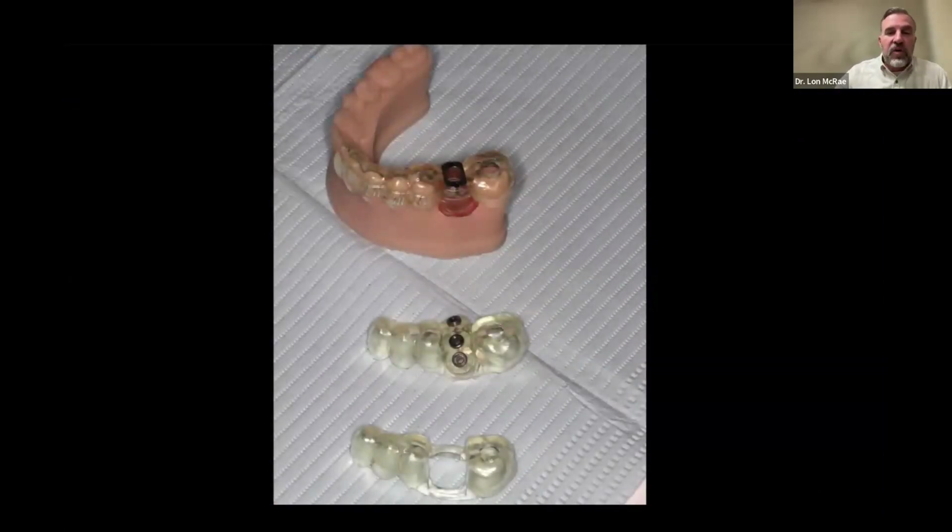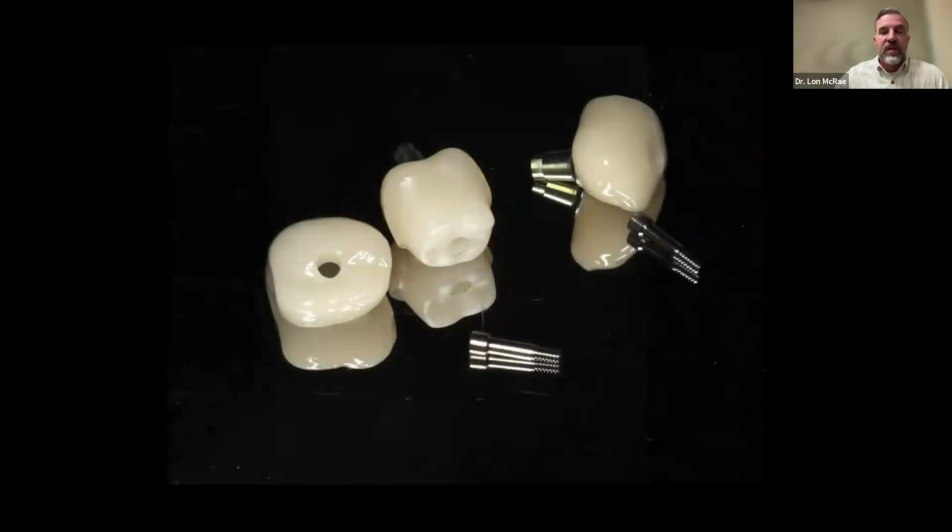So what do I get from the lab? This is what I get, a surgical guide. I then have a guide to be able to go through the furcation. So it's a guide that gives me the ability to split the root in a very precise way. And I have an occlusal guide to use just before that. So I get 3 guides, all from the All-In lab, to be very successful and know that I'm very precise. This is as well what I get from the lab.